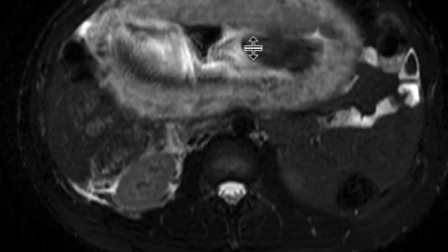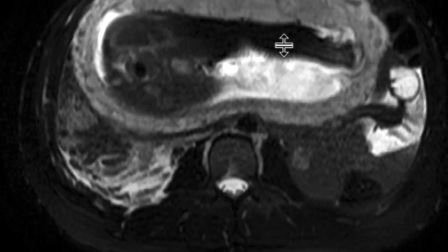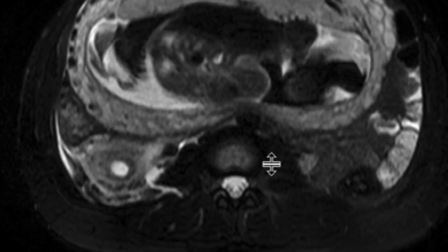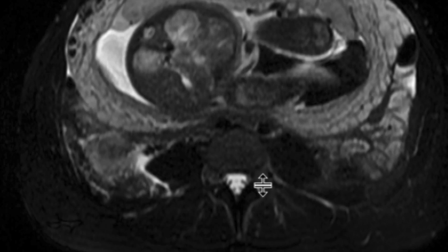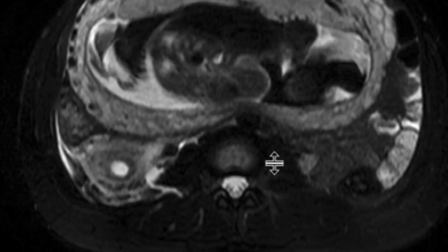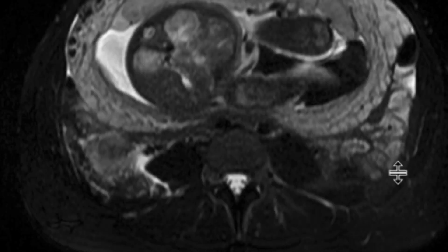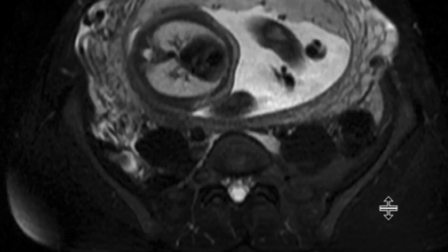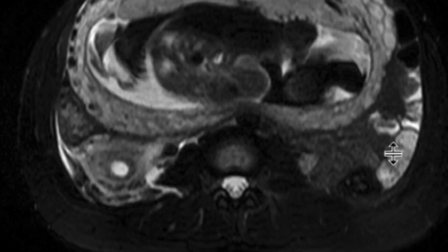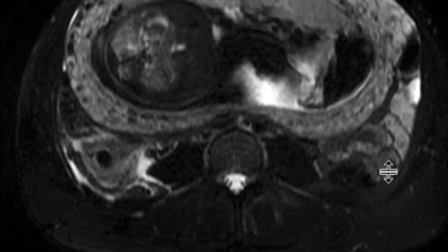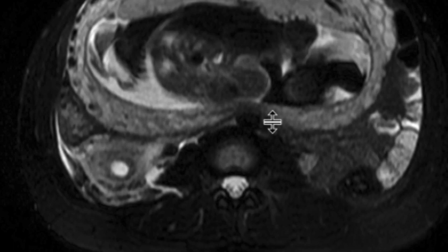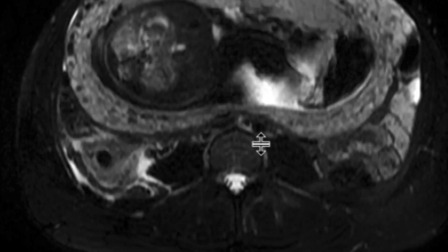On this T2 fat sat sequence, as we scroll downwards, we can see the gravid uterus and the fetus. I want to draw your attention to the right lower quadrant, where there's a lot of inflammatory change. We're already suspicious that something is going on there, potentially appendicitis. There's also a little signal void, which may represent an appendicolith in this setting.